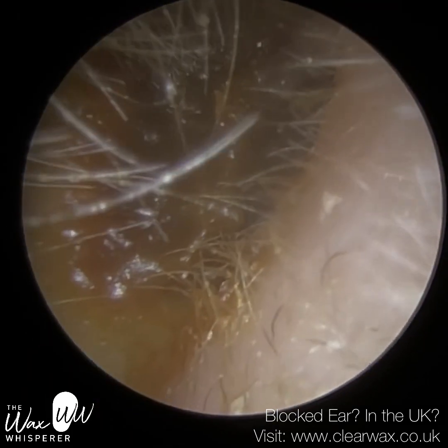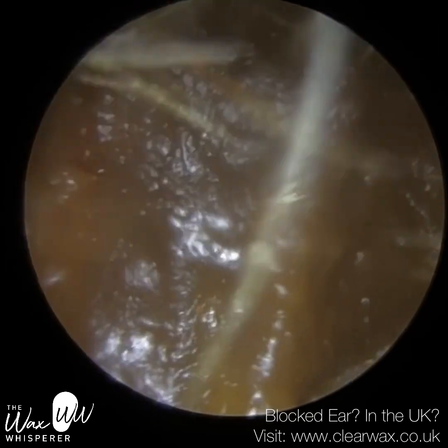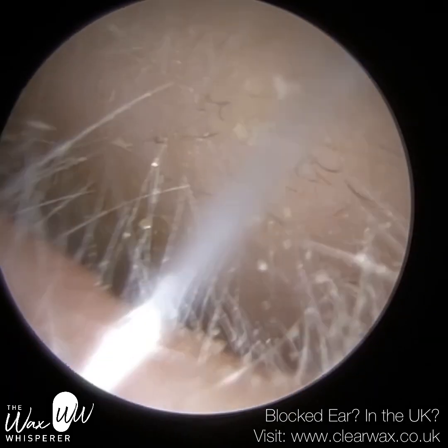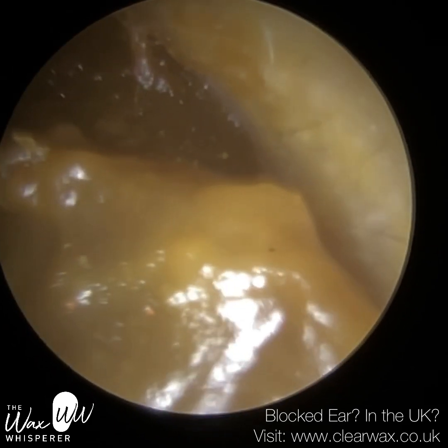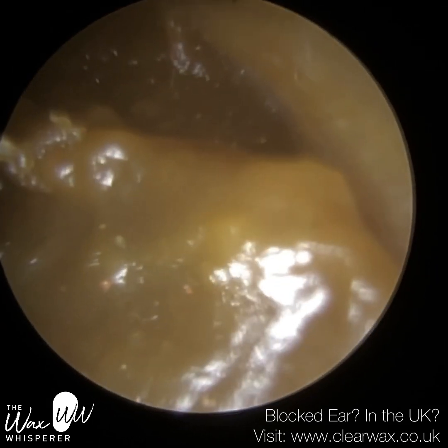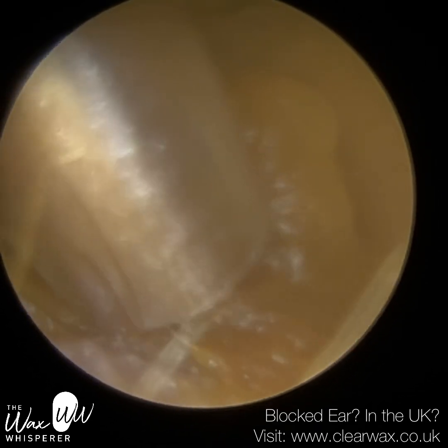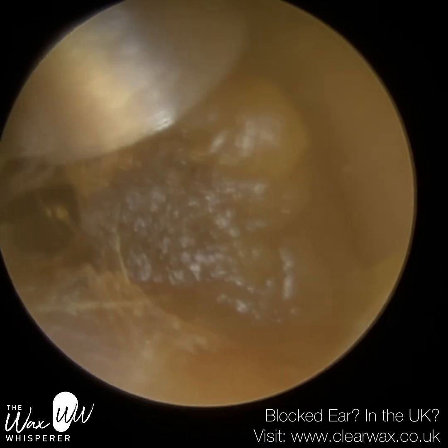We have here a patient who attended with bilateral, fully occluding, soft, sticky, fudge caramel-like consistency earwax. And I'm just commencing with their right ear. This is the ear that they felt to be the worst. And as you can see, this wax is quite dense.